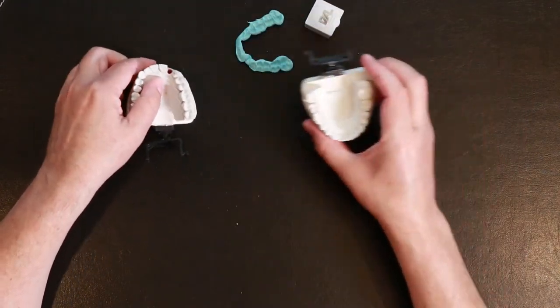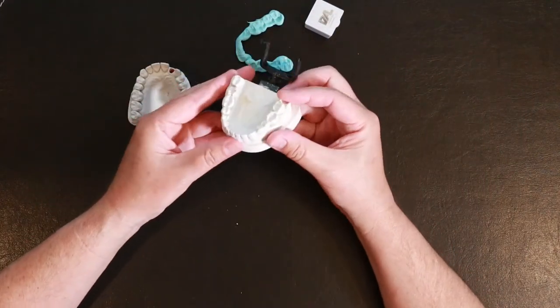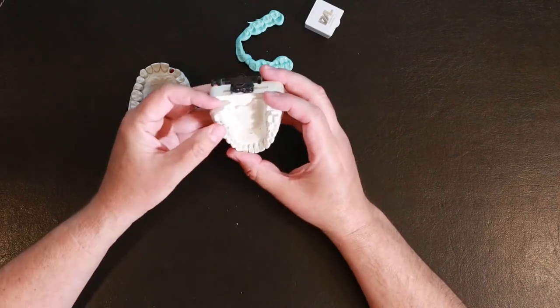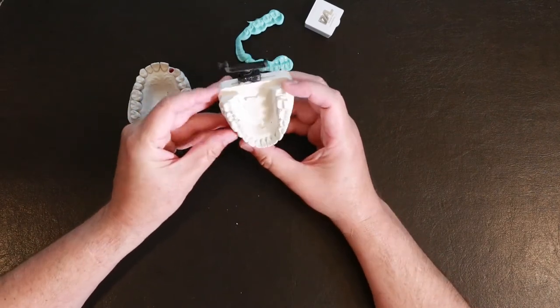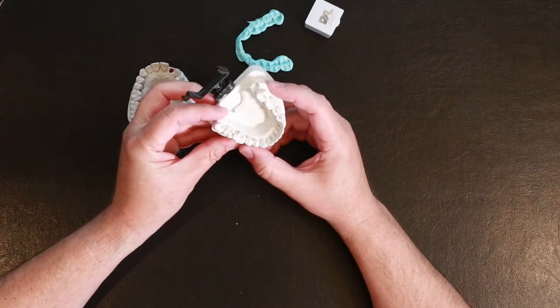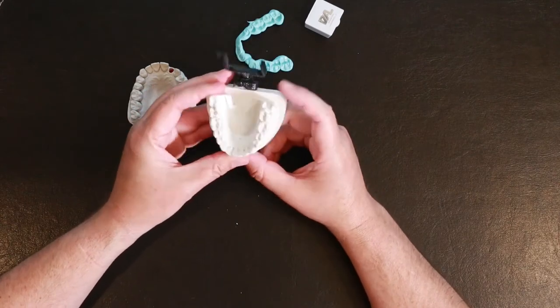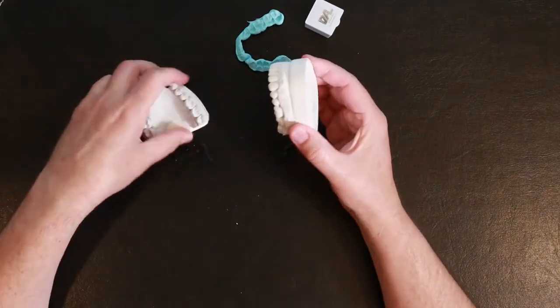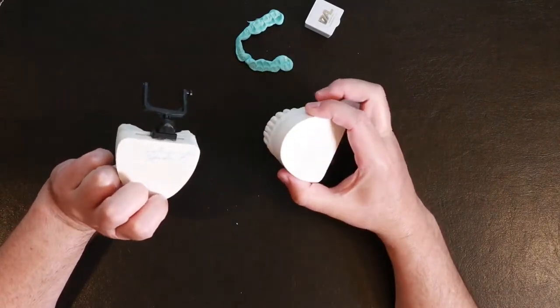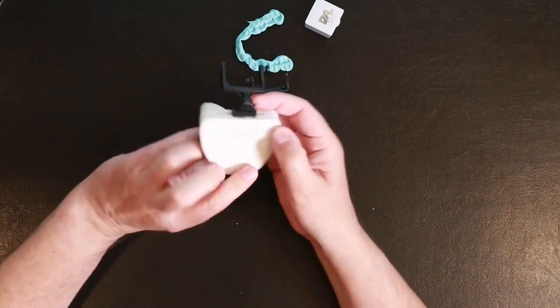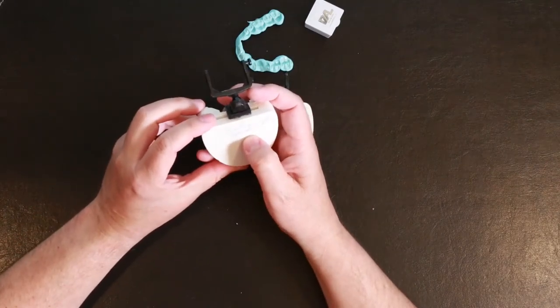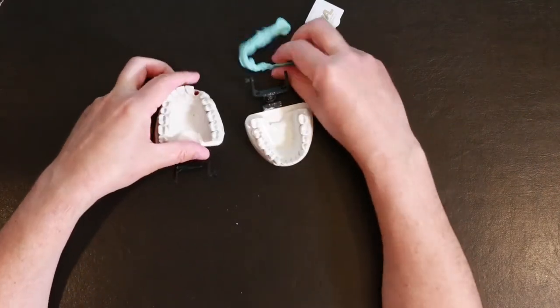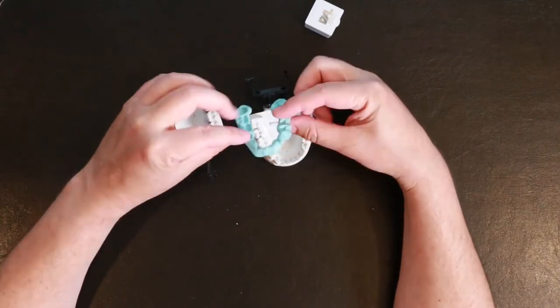This was the lower model that I poured up from that alginate impression that I took. I poured this up in my office and I sent it to them. And then they mounted it, put nice plaster bases, even labeled it my last name and that it's for a typodont. And then this is the bite registration I took and this showed them how the teeth fit together.